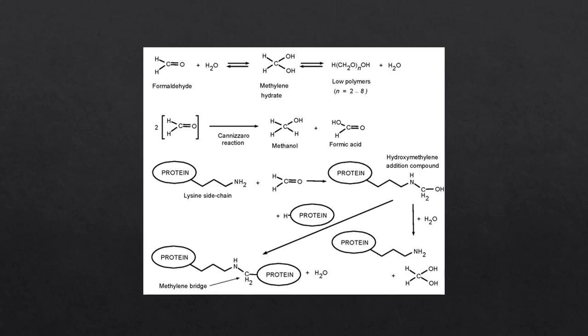Why do we fix the tissue in formalin before making a paraffin block? Well, let us try to understand why we need fixation in the first place. Cells are compartmentalized heavily. However, when the organism dies, autolytic enzymes in the cell begin destroying the cell from the inside out. Furthermore, fixation also makes the membranes of cells more porous. This allows for antibodies and paraffin to actually penetrate the cell. If antibodies are unable to get into the cell, IHC procedures would not be possible. Thus, fixation is a bare necessity for IHC procedures to occur.